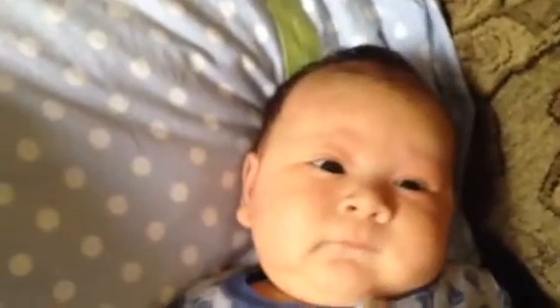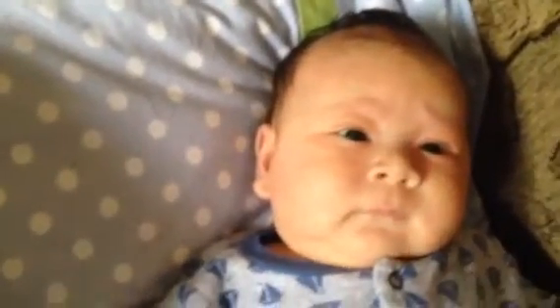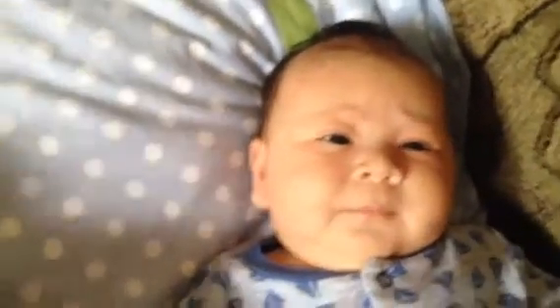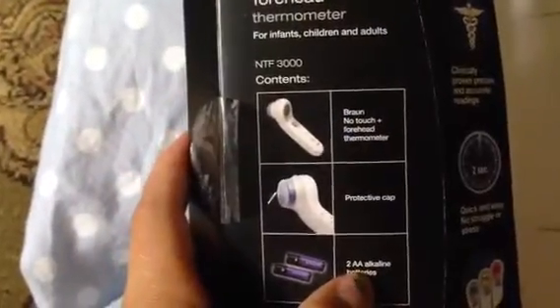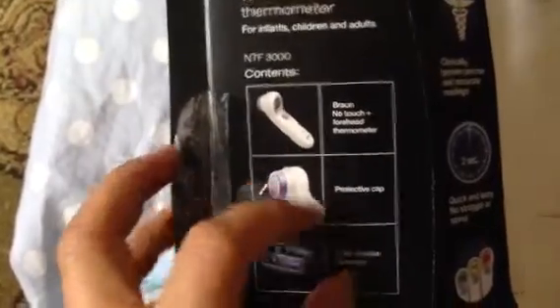This is great — this is just in time because he just got his two-month checkup and he got three shots, so I'm happy I got this so I can keep an eye on his temperature. It came with two double-A batteries and a protective cap.